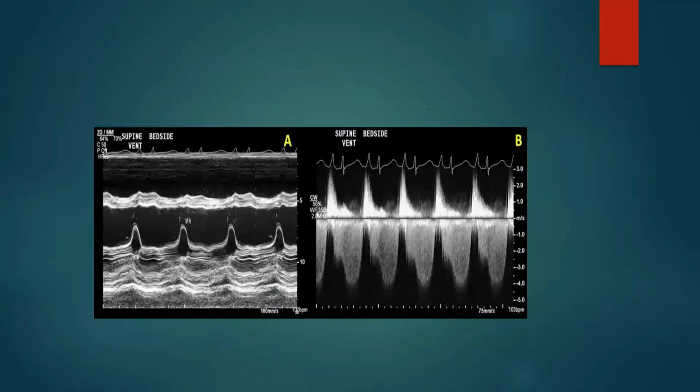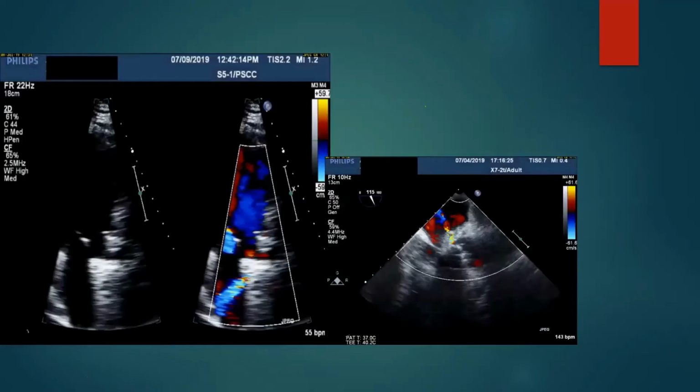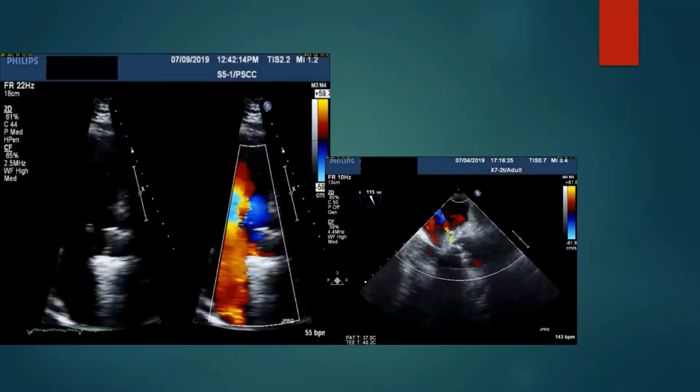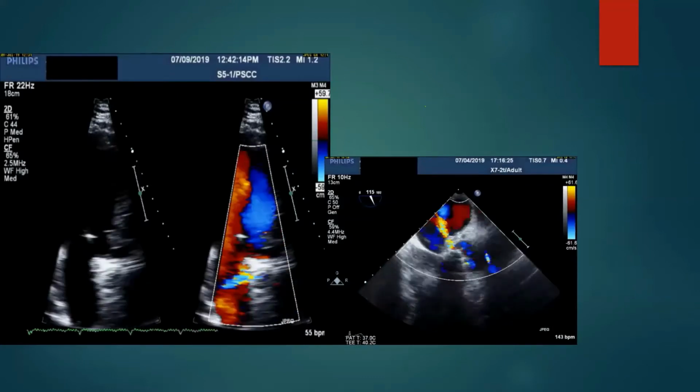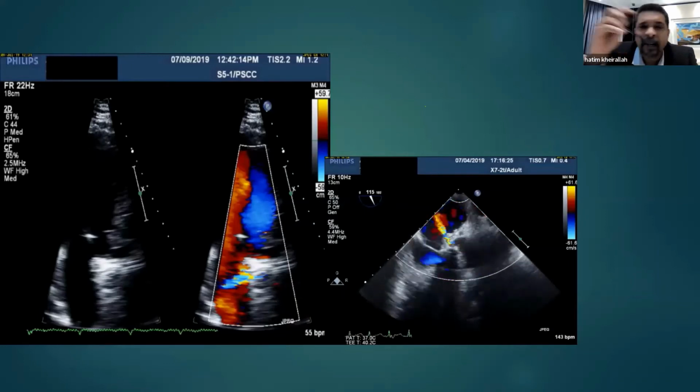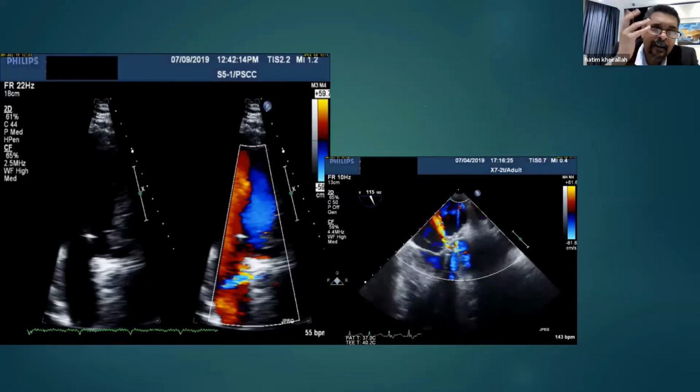Now, Victor, yes. Can you tell me how you differentiate? I know it's not common to find a ruptured sinus in the LA, but is there any way to differentiate between fistula and rupture? Fistula and rupture, no. Here the fistula is in fact a rupture.